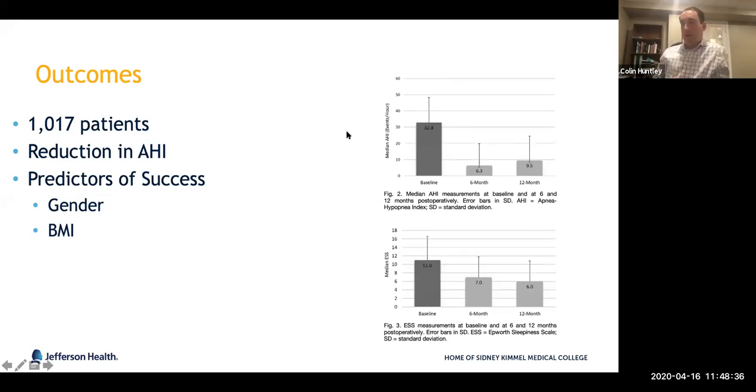We don't think titration studies are the best assessment of postoperative outcomes, because it's really only a small time period that you're assessing their sleep. You might get a value for 30 to 60 minutes from the course of the night, whereas more of these 12-month studies were probably home sleep studies assessing full night outcomes. And with this paper, they also looked at predictors of success.